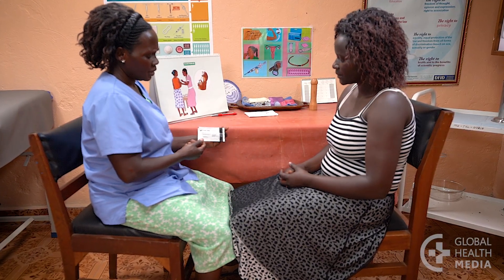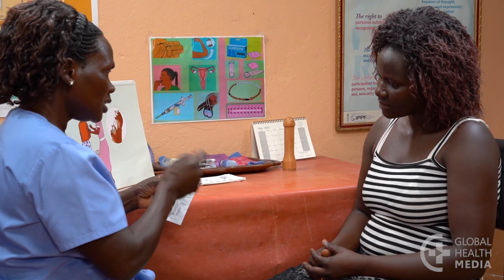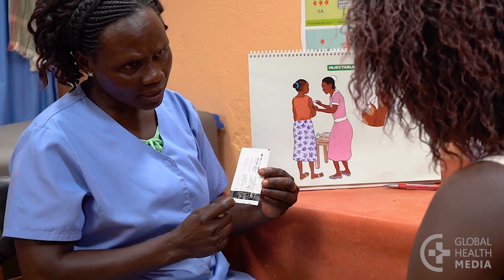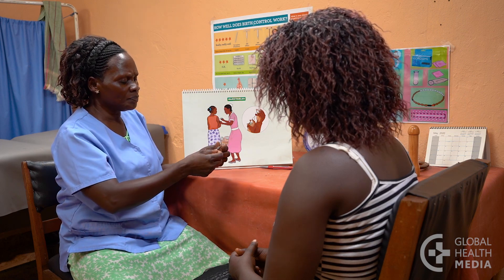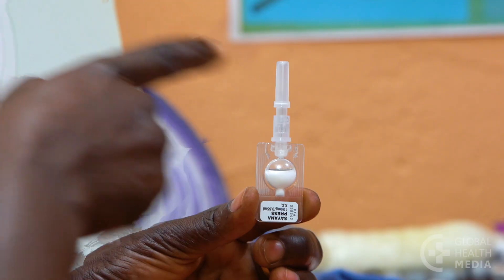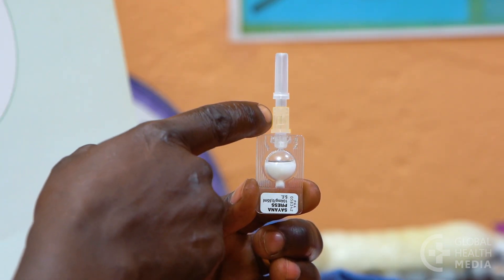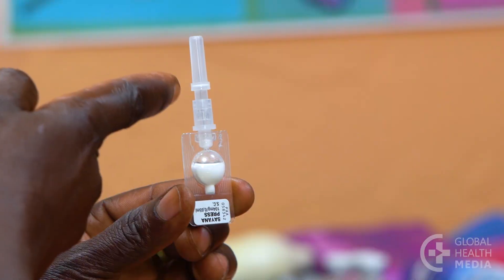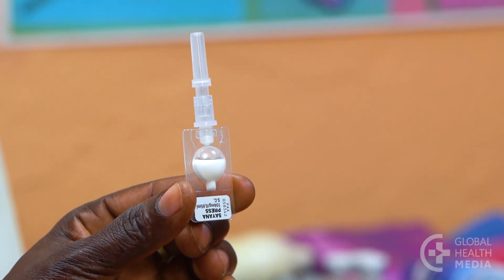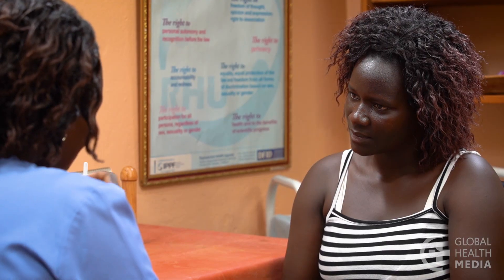When she has decided, teach her how to use the syringe and inject herself during the visit. First, show the woman how to check the package to be sure it's not damaged and not expired. Next, open the package and remove the device. Show her the four parts: the cap, the gap, the port, and the reservoir. There should be a gap between the cap and the port and no medicine leaking. If anything is wrong, tell her to discard that device and use a new one.